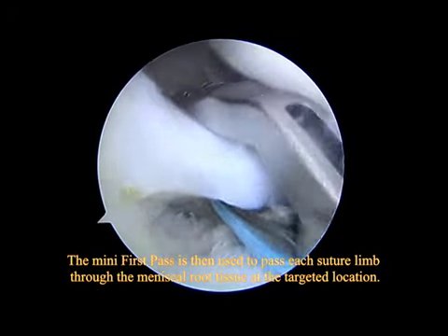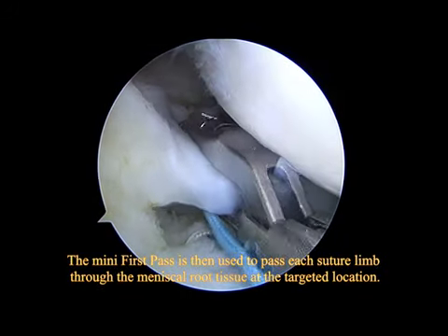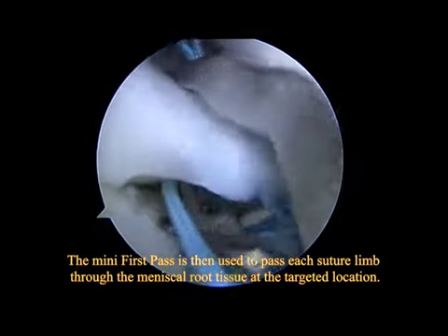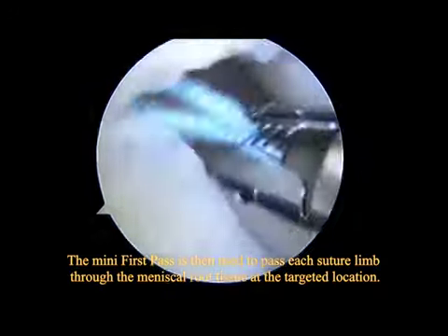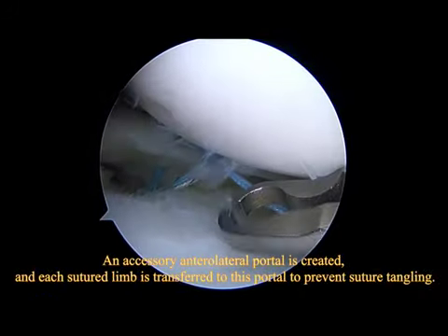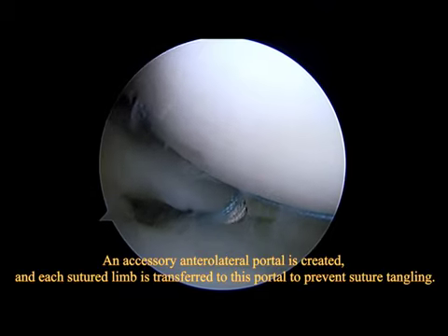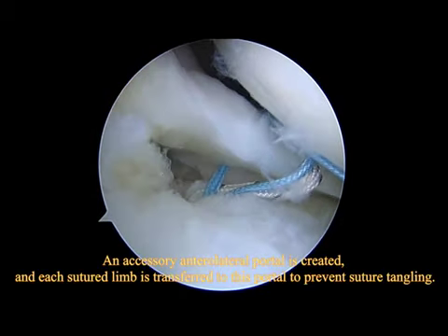The mini first pass is then used to pass each suture limb through the meniscal root tissue at the targeted location. An accessory anterolateral portal is created, and each sutured limb is transferred to this portal to prevent suture tangling.